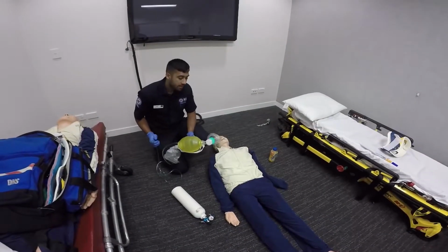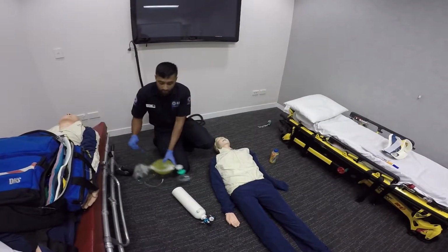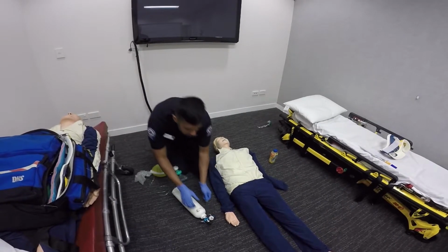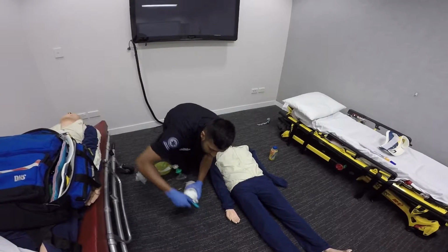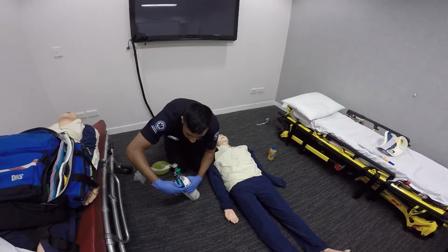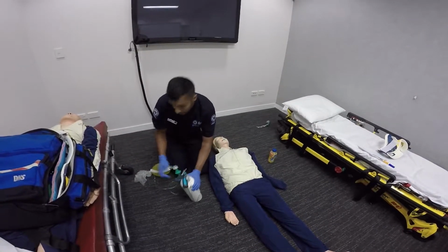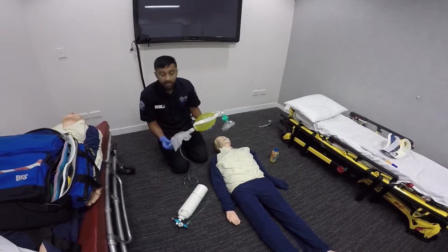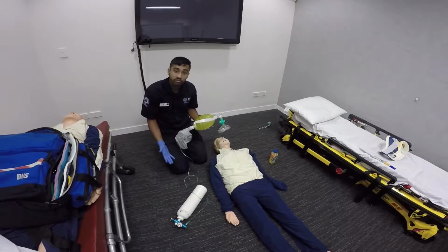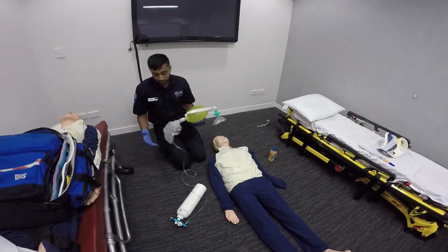So I'm just going to use a bag valve mask and reservoir for the patient. So what I'm going to do is I'm going to attach the oxygen tubing to the regulator. I'll turn on the oxygen and place it on at 15 liters per minute. We can see that the reservoir bag will slowly start to inflate. In this case, we don't have a lot of oxygen left, so it most likely won't inflate.